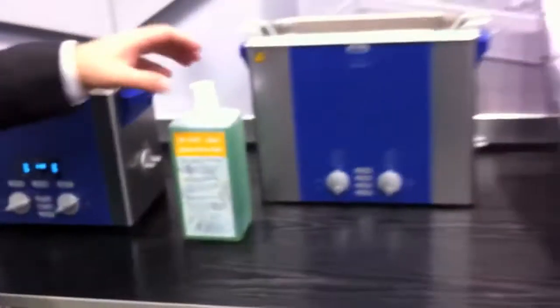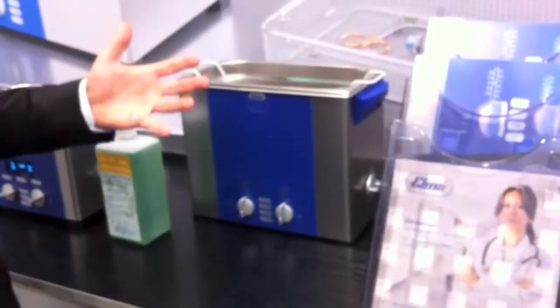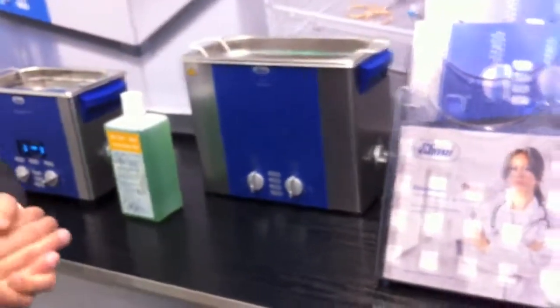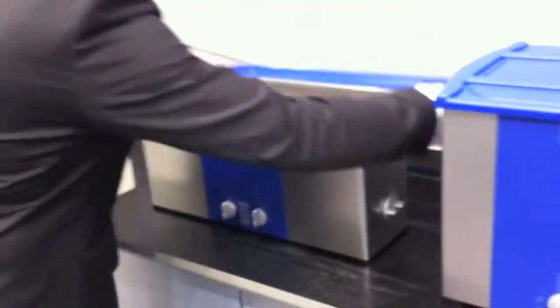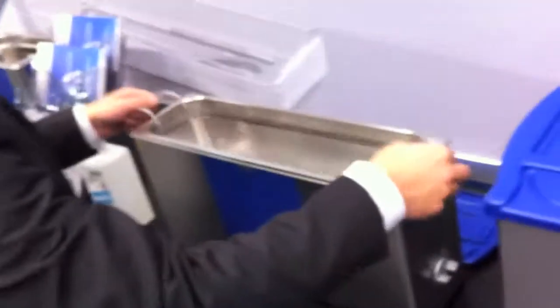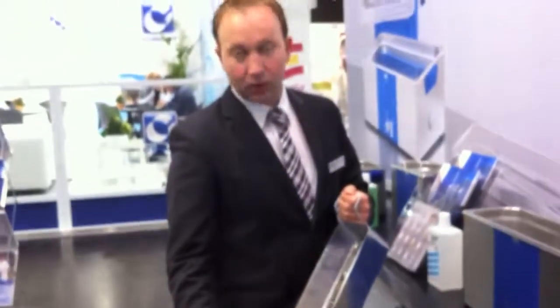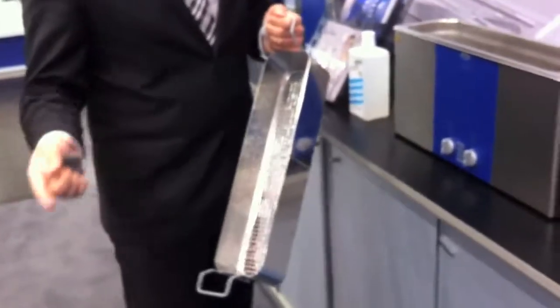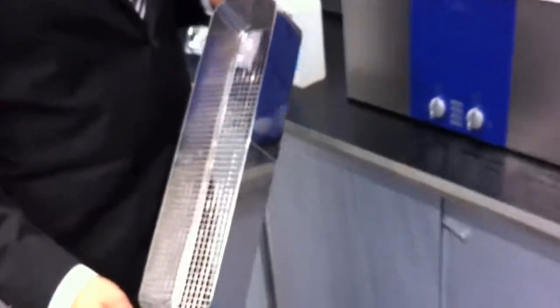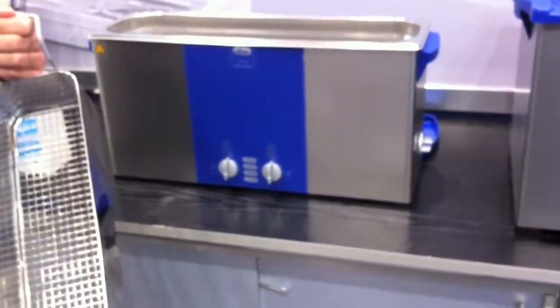Further on, we have the six liter version for standard instruments but a bigger quantity. Very interesting is also this long machine here with a long but narrow basket for needles, small scopes, or other long items. This machine is very handy for tray cleaning especially directly in the operation theater before the instruments go to the CSSD department.